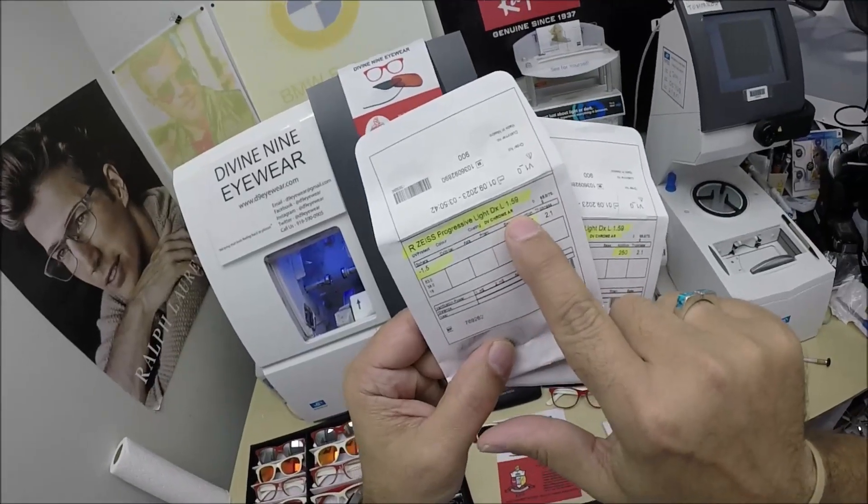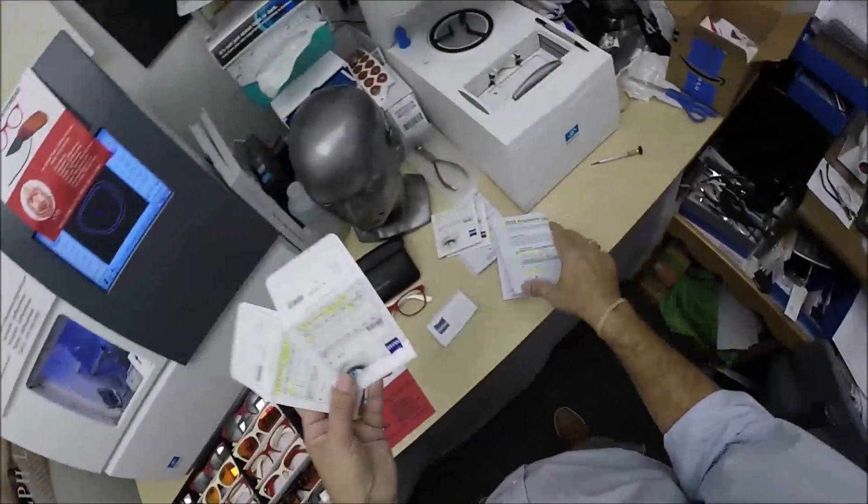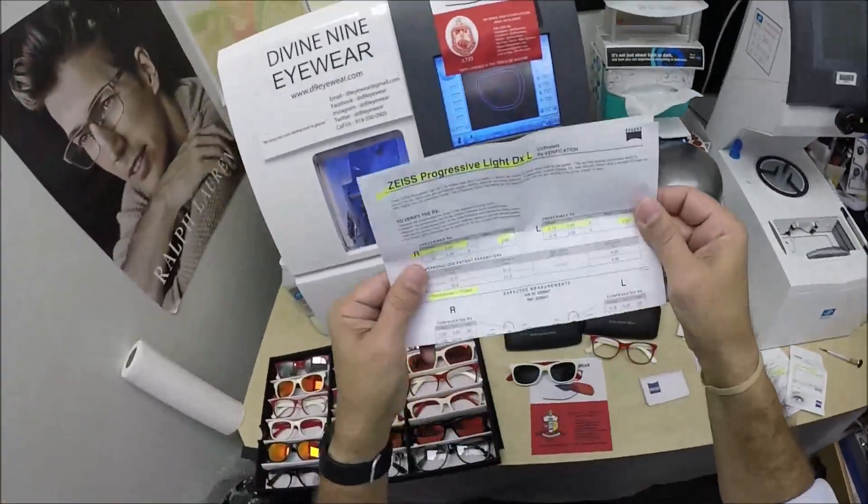I've highlighted the DuraVision Chrome anti-glare treatment, the prescription for the right eye and add power, same for the left. I document all of that so you know exactly what you're getting, even though the coatings are invisible.